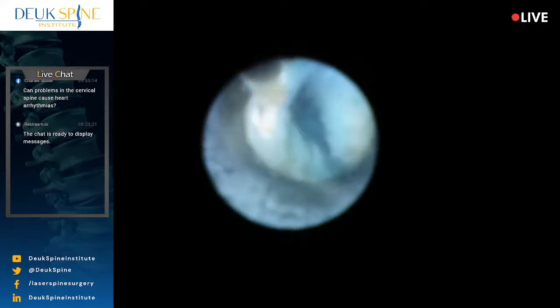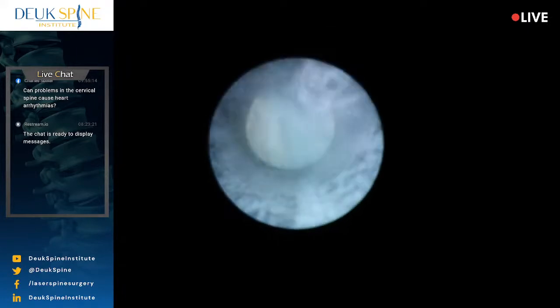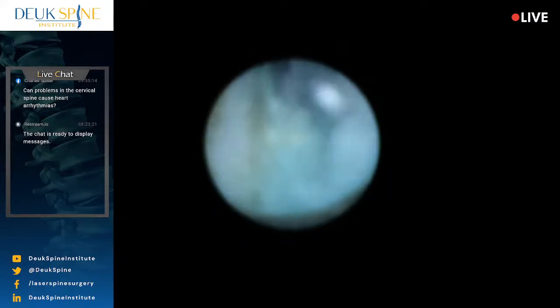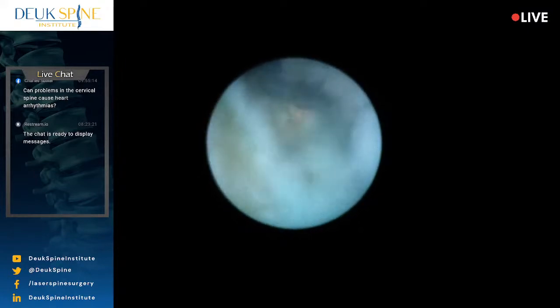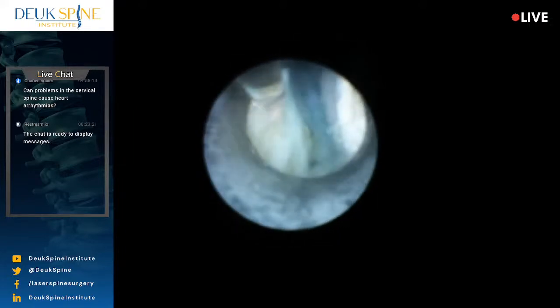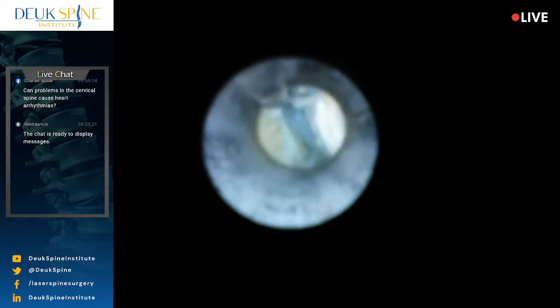Yeah, definitely. I think we need to have a talk with them, Luis, because whatever they're using, that glue is just not holding after you autoclave. I told you, you've got to call them and talk to their technician, and say, what glue are you using? Give me the name. And if they say Elmer's glue, I need you to report them. The glue that has to be used has to be autoclavable glue, meaning it has to stand up to the temperature and pressure of an autoclave. That's how we clean our surgical instruments. All of these instruments we use are cleaned with an autoclave.